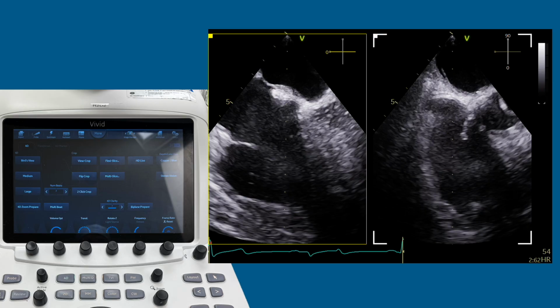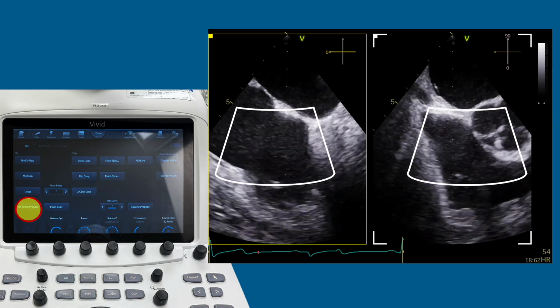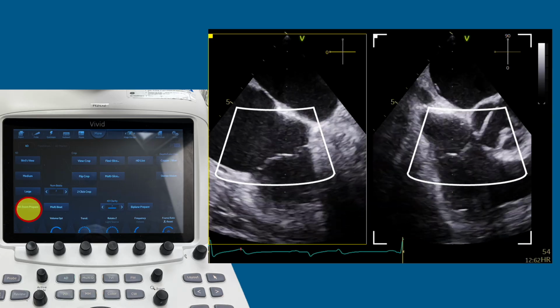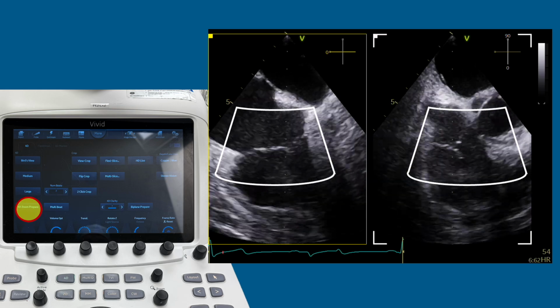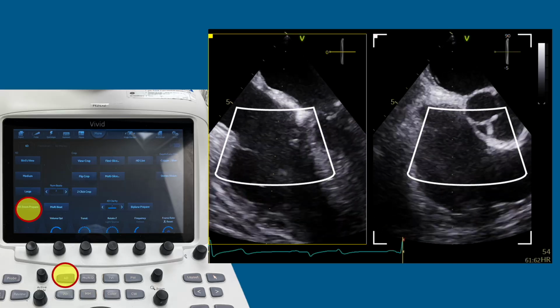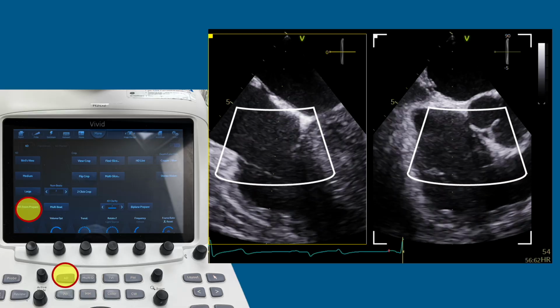This is a closer look at the buttons on the GE E95 capacitance screen. To prepare a 3D volume set with an area of interest in mind, first you would press the 4D Zoom Prepare button on the LCD screen. This will give you two sectors on the imaging screen by which you can identify the area of interest. You will resize your sectors to capture your region of interest, and once you've done so, you will press the 4D button on the console to generate a 4D volume set.